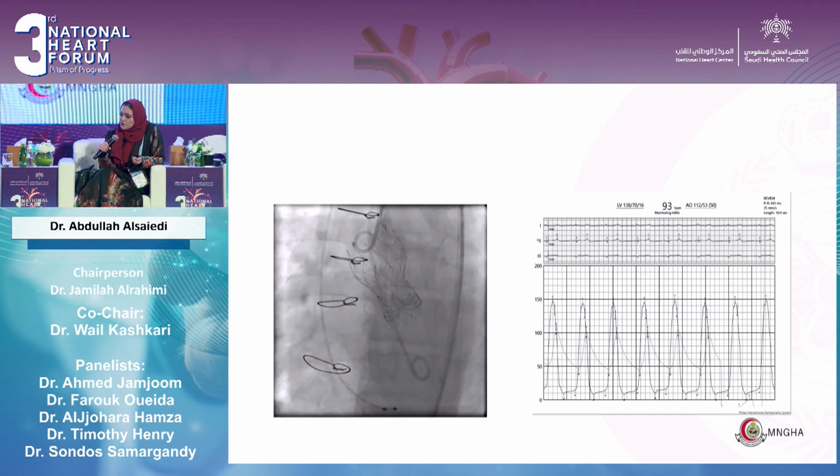And at the end of the day, we're not only treating the numbers, we're treating the patient. So we have to take into consideration how much the patient is functioning and moving, what the weight of the patient is, the height, and Abdullah has demonstrated that we can go a bit with our hemodynamics.